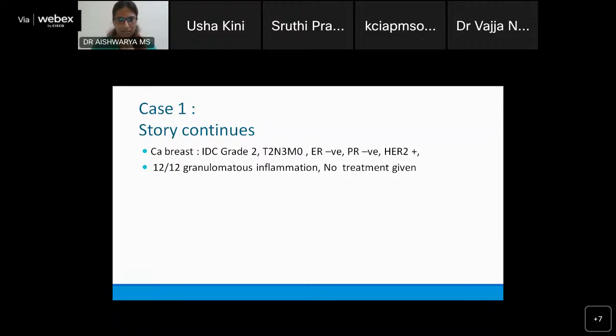And mind you, this patient had not been started on any treatment. She preferred this rather than go on to NACT. Now, as we had these issues, all 12 granulomatous lymph nodes were AFB negative. And we did pan-CK. Do you know why we did pan-CK? Ma'am, CK can be done for any epithelial tumors, spindle cell. Why in this case?